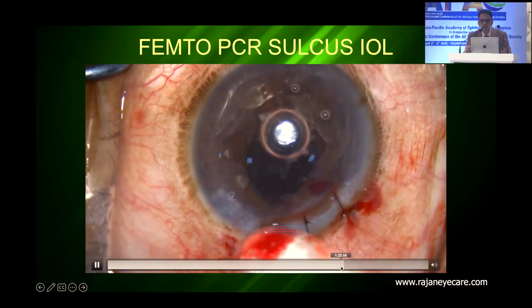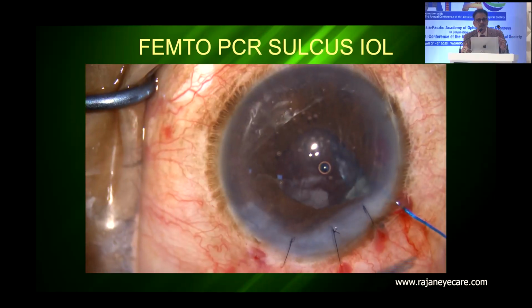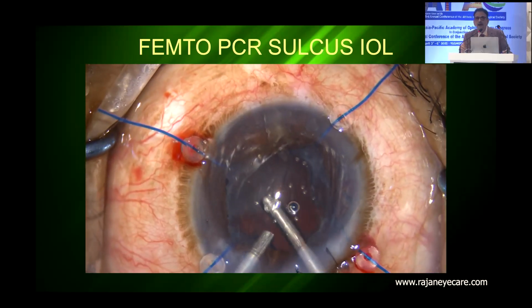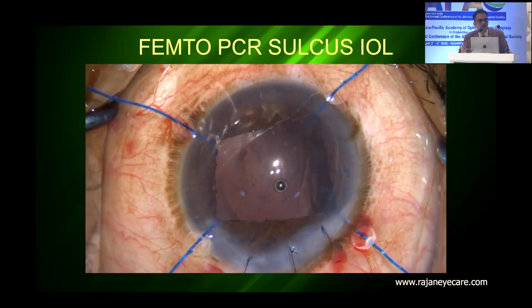When you have a PC tear, what happens is the pupil becomes small. You do not know where your sulcus is. Then you put a lens in a small pupil. One haptic will go underneath the rhexis margin, and the other haptic will go in front of the rhexis margin. Okay, and then next day you find the lens on the macula. Okay, but I'm just telling you.